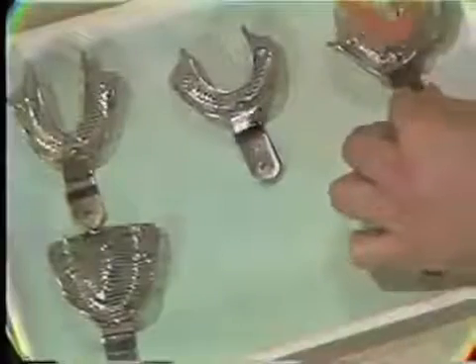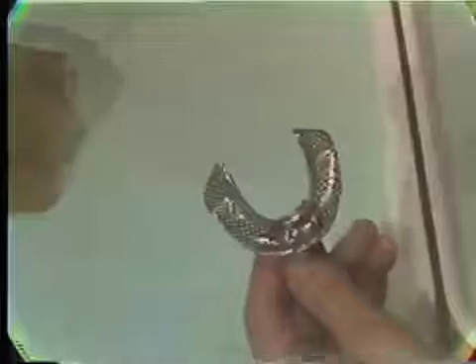The mandibular denture is used similarly as an aid in selecting the proper mandibular tray. The appropriate tray is tried in the mouth to check possible impingements. It is then modified with red rope utility wax as needed, in this case the distolingual flange area.